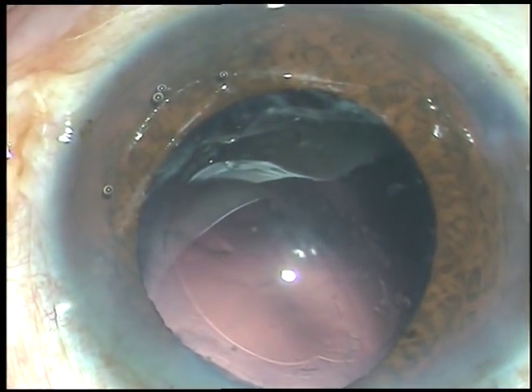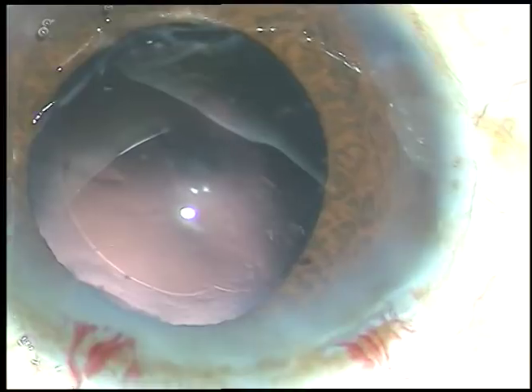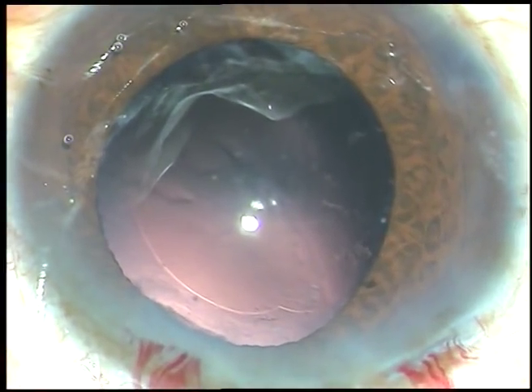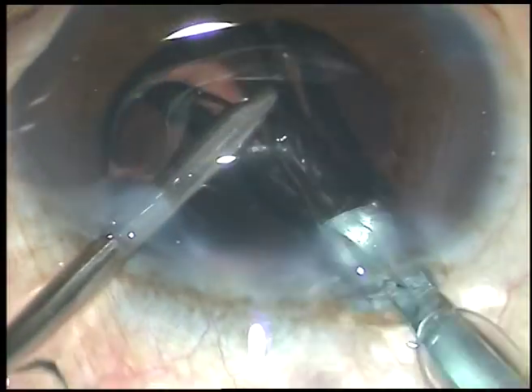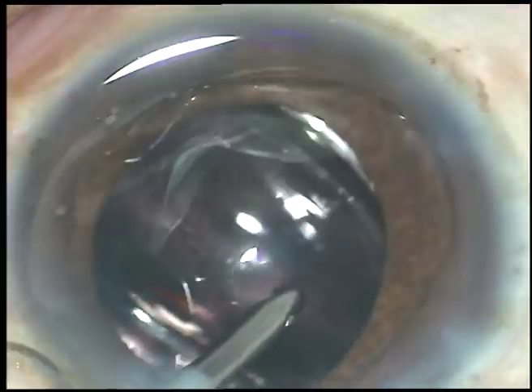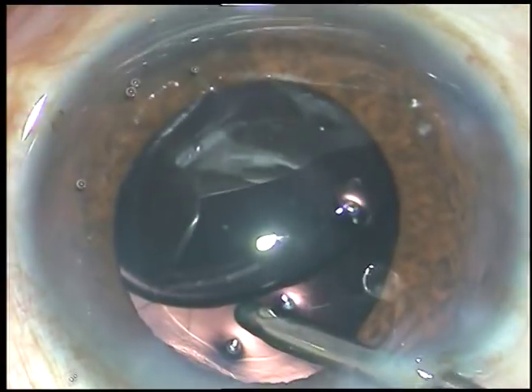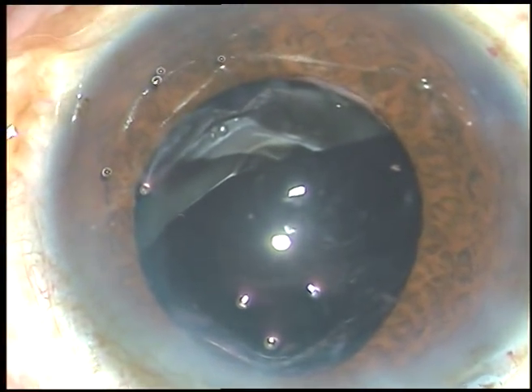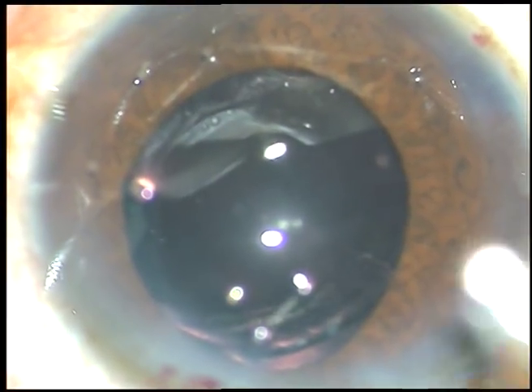The cortex has been removed and now is the time to implant an intraocular lens. This is a totally unedited surgery — you are watching each and every step. This is a hydrophilic acrylic intraocular lens. This patient belongs to our free service category and we can't afford a hydrophobic lens in such cases. In our center, we do about 30% free surgeries and 70% paying surgeries.